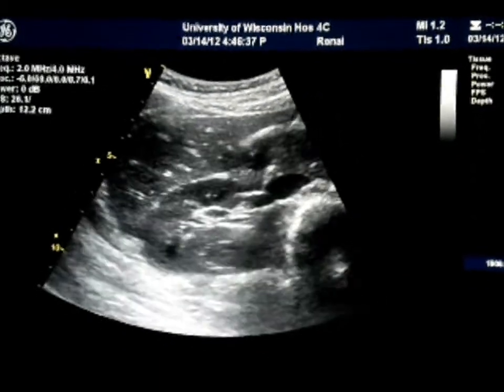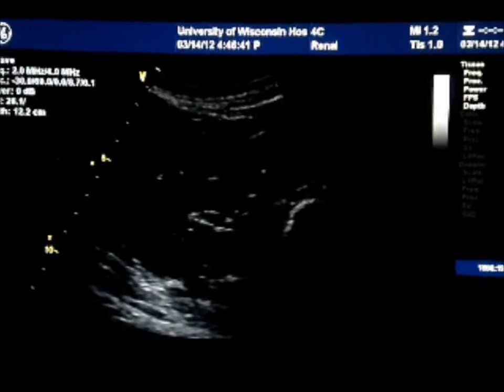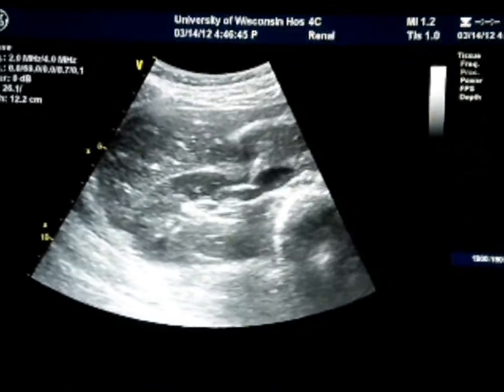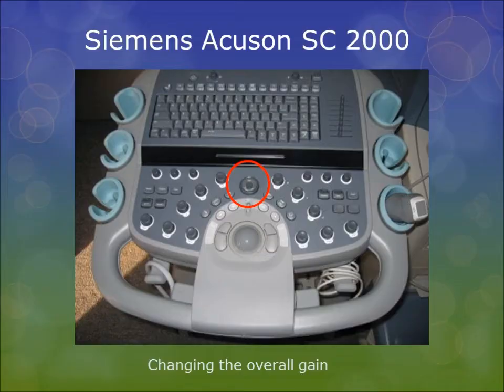Notice how when the overall gain is decreased, the kidney and its surrounding structures become very hypoechoic. As the overall gain is increased, the entire image becomes hyperechoic. Turning down the overall gain for the thyroid image did not have as great of an effect compared to the mitral valve and kidney images. However, when the overall gain is increased, you once again notice this snowball effect.